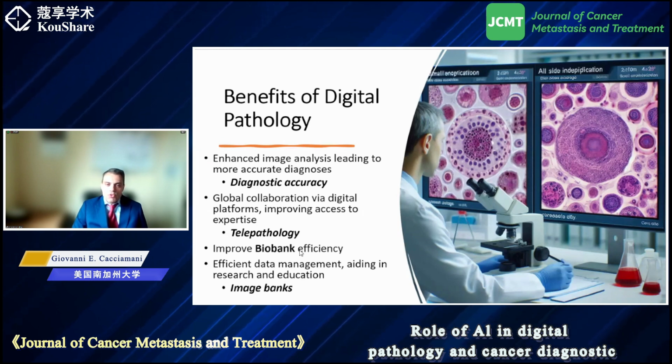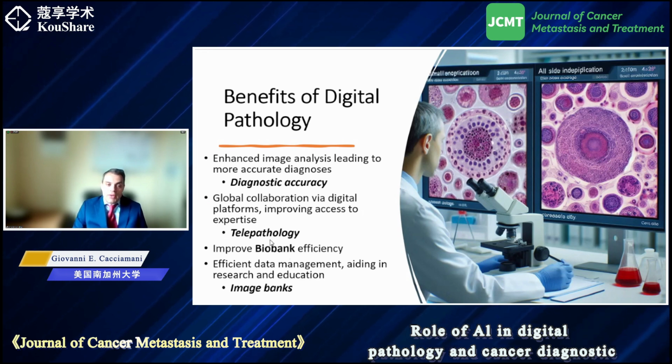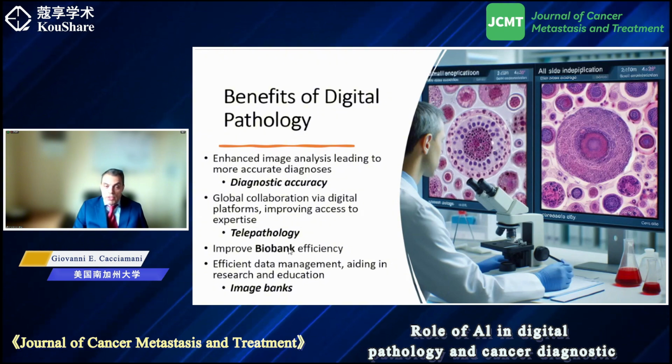Now, I'm sure that most of you would agree that it's quite difficult for a researcher to analyze, maybe investing a lot of money, maybe for next generation sequencing, metabolomics, or whatever, cases that we cannot really revise from the diagnostic point of view, assessing how many tumor cells are in the tissue and what the reactive components are. So having a window, like in a shop, with digital pathology would increase the use of biobanks and therefore increase research worldwide.